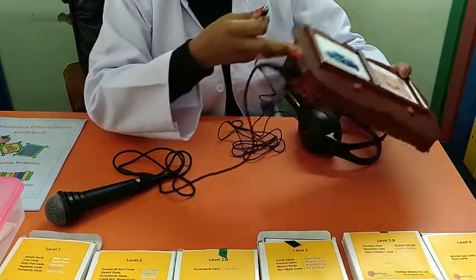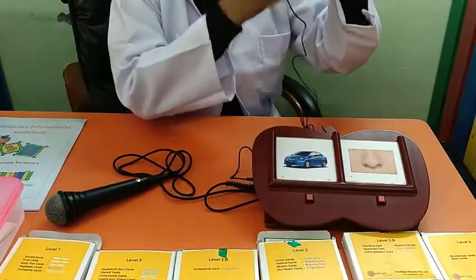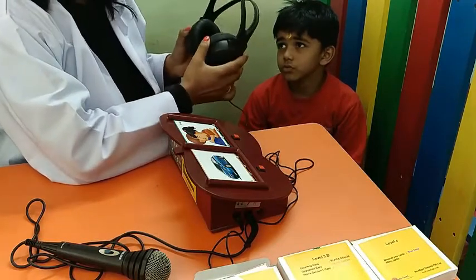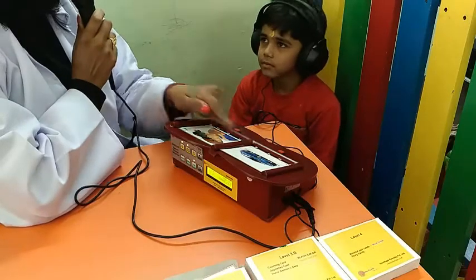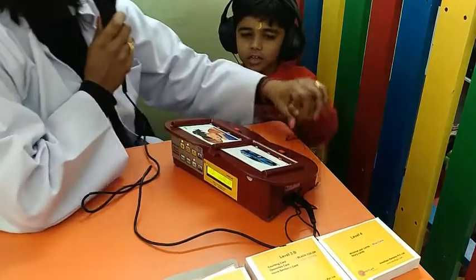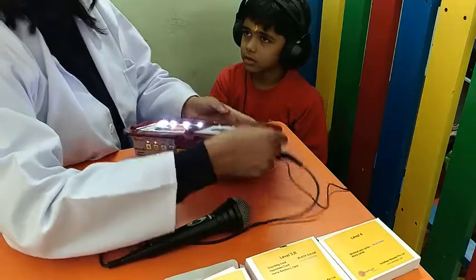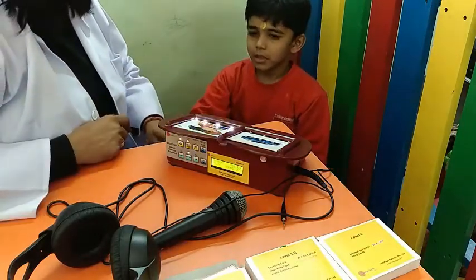If the child is comfortable with headphones, we can plug in the headphone into the device and the same sound will come through the headphone. For example, teaching this child a sentence card — he is not having any sensory issues, so he can easily place the headphone and the output will go through it. For example: 'This is car. This is car. Car is a land transport.' If the child is not comfortable with the headphone, we can remove it. 'They are happy. They are happy. Where is the girl hugging with her brother?'